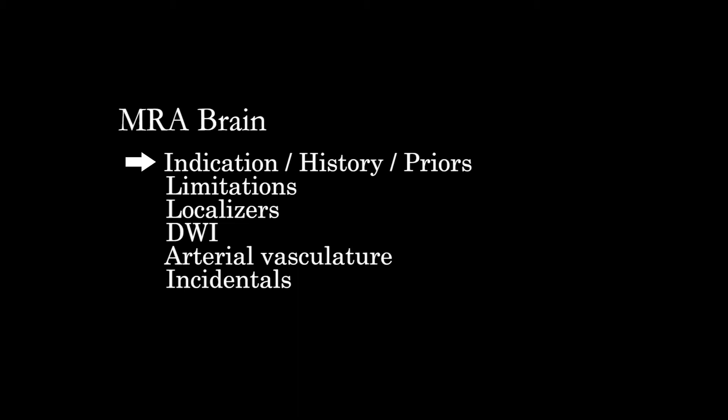You want to get a sense of what type of exam is being done, because that's going to impact the steps we undertake. At different institutions, you'll acquire different sequences. At our institution, we frequently do DWI sequences and localizers as well. On the time-of-flight MRA images, you'll see anatomy that is not just the vessel, so it's important to remember you can pick up incidentals and potentially explanatory findings — things in the brain parenchyma or other incidentally imaged tissues, not just the vasculature.